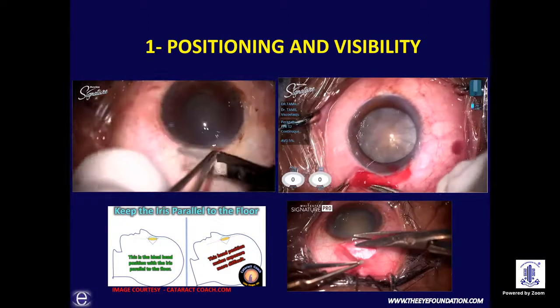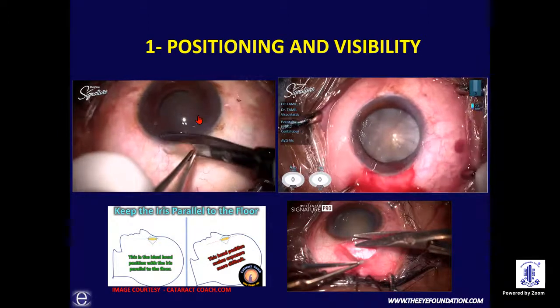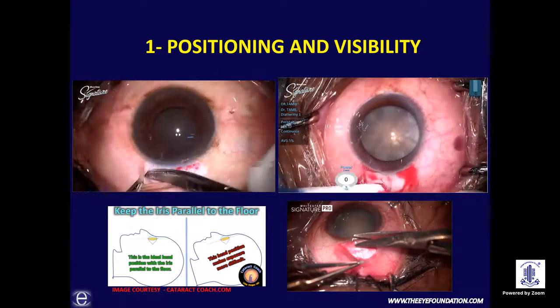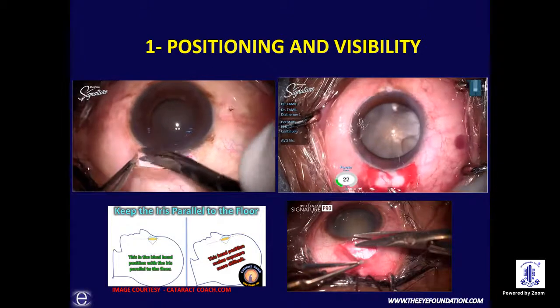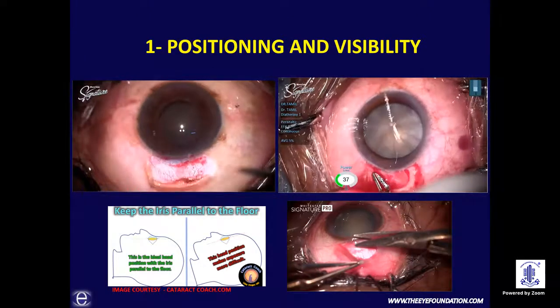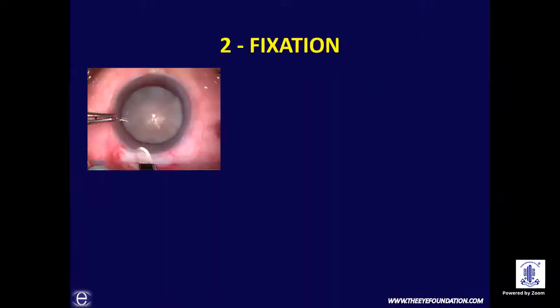For a beginner surgeon, I advise always to give a small relaxing cut at the extreme other end so that the conjunctiva does not fall back, and give a judicious cautery of the bleeders so that the oozing is not there. For a superior tunnel, the superior rectus bridle suture plays an important role, where it rotates the eyeball down and also gives traction for performing the tunnel.